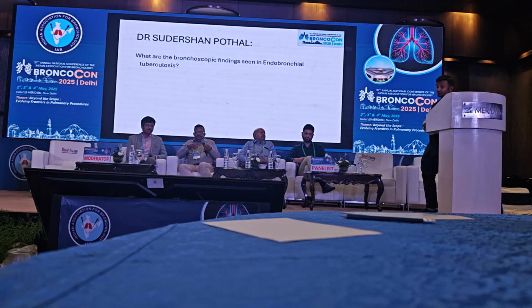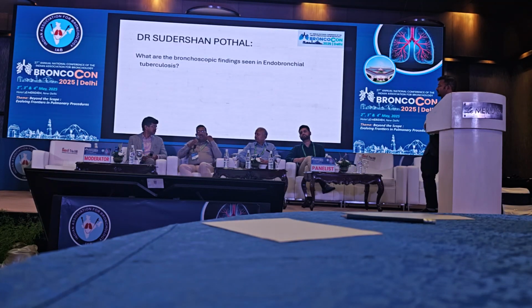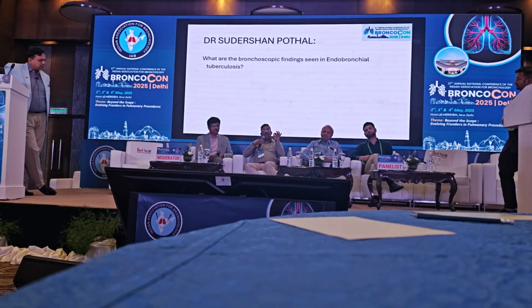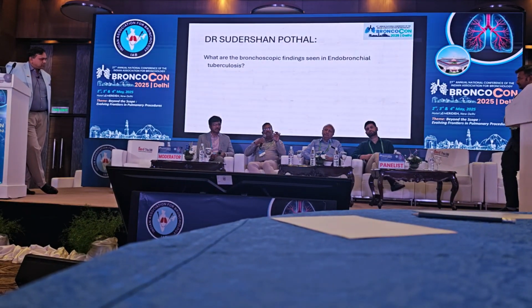So, next question to Dr. Sudershan. What are the bronchoscopic findings usually you see in endobronchial tuberculosis? Right. Basically, endobronchial tuberculosis. So before I go to the findings, classically, whenever we are telling endobronchial tuberculosis, it has to be confirmed either histologically or microbiologically.